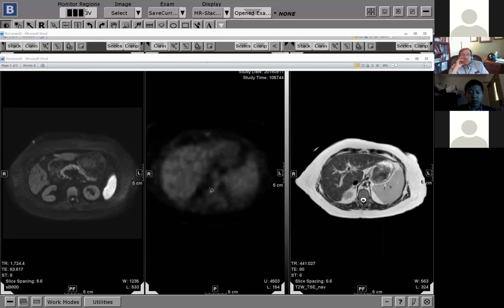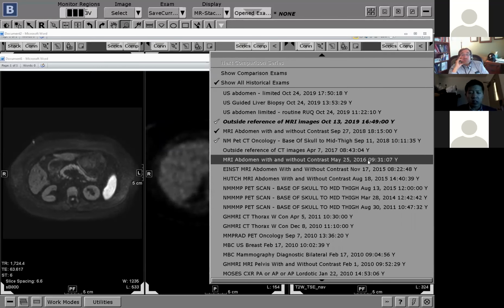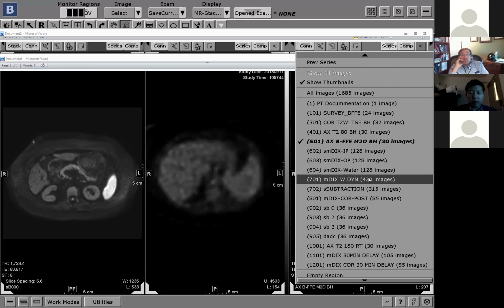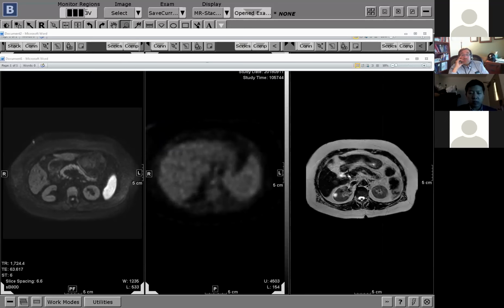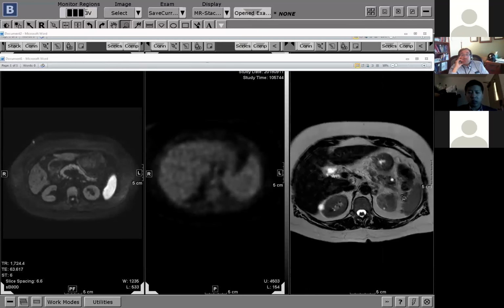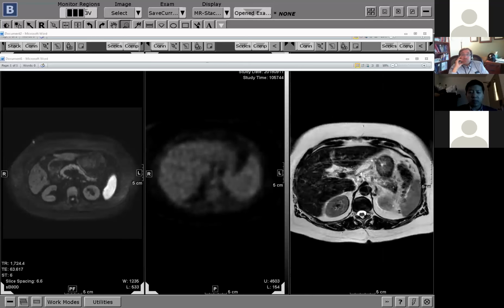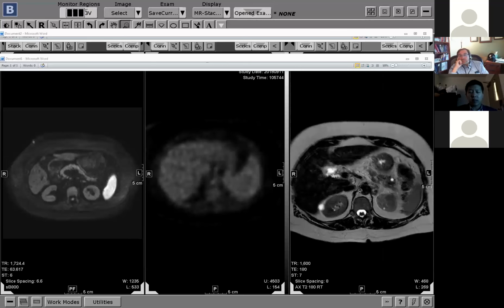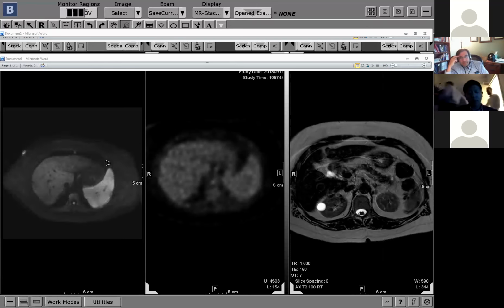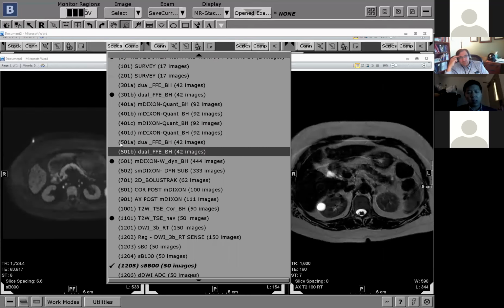But it turned out to be something, and when I kept looking back, all the way back to maybe 2016, you can see that the tail is not as atrophic. But between 2016 and now, she has Hep C, and we have a lot of patients with substance abuse. It could have been just that, I don't know. So it's hard for me to judge. Would I have said something differently had they given me a different indication?